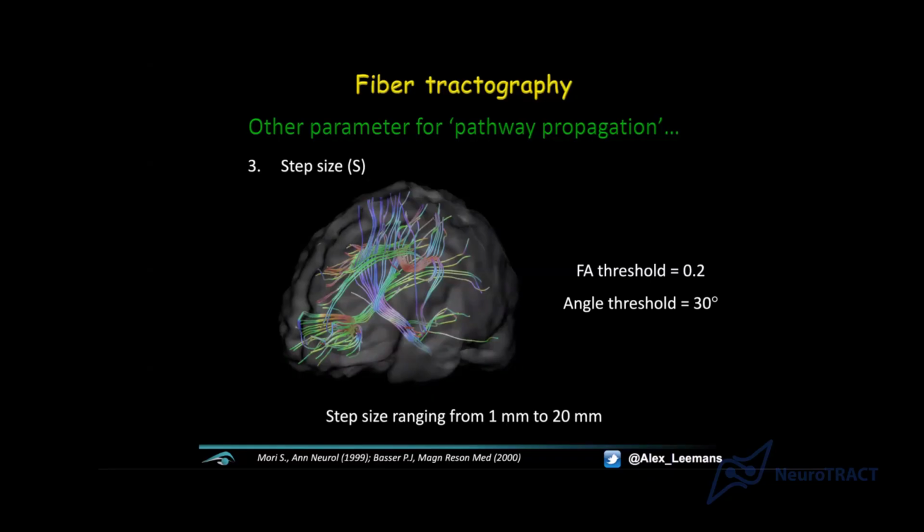But in any medical device, when you're acquiring data, also discretely, then these voxels have physical dimensions. This is called a voxel size. So there's literally a width, a height, and a depth to a voxel. Ideally, we always acquire voxels isotropically, meaning that these dimensions of a voxel are the same. So we talk of a voxel of 2 by 2 by 2 millimeter, for instance.